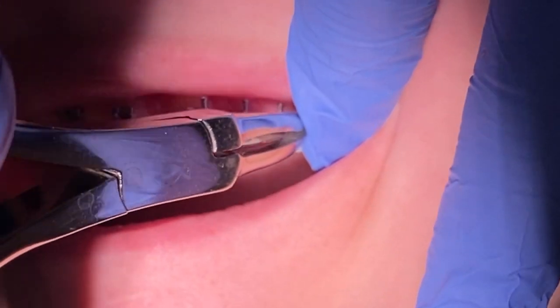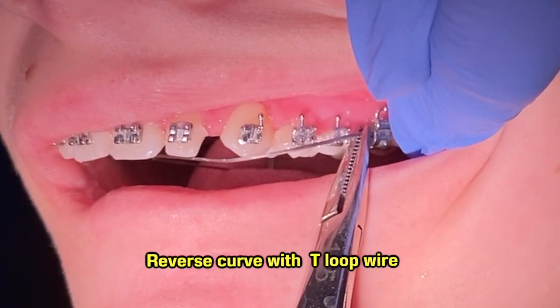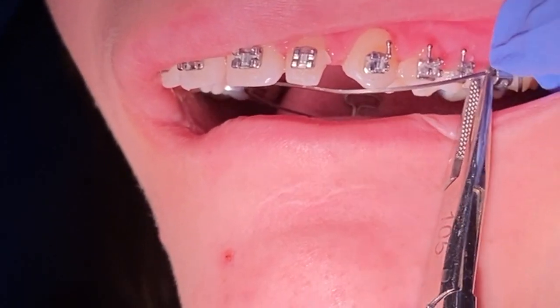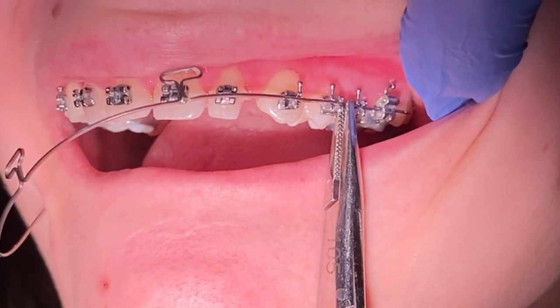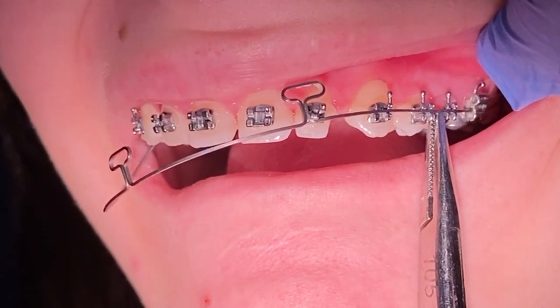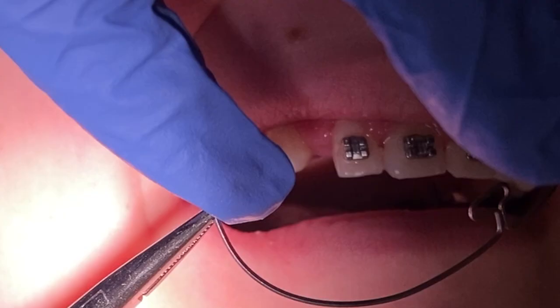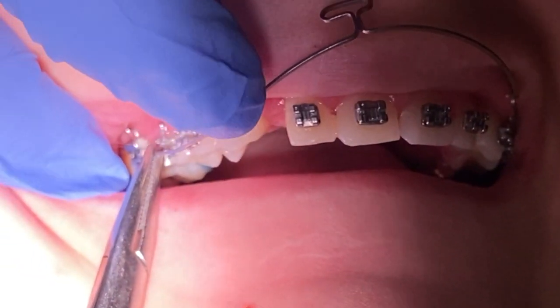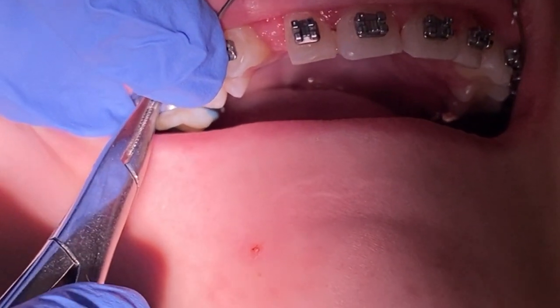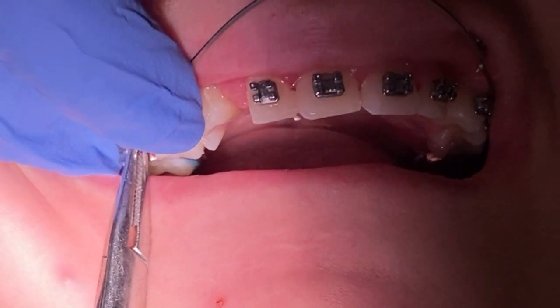Now we're going to go ahead and place the top wire. This one is called a reverse curve T-loop wire. It holds a lot of force — the reverse curve shifts your bite in a different direction. If your teeth are flared out, like a pringle, it's going to flare them back in, bring your bite in a little, and also close some spaces on the top or bottom. Because this wire gives a lot of force, I'd highly recommend eating something before your appointment, and know that you might be sore that week — take some Tylenol or eat some ice cream.